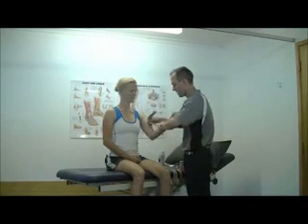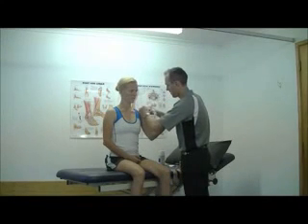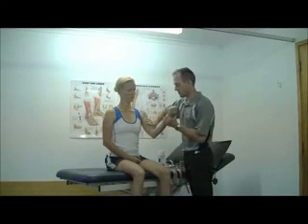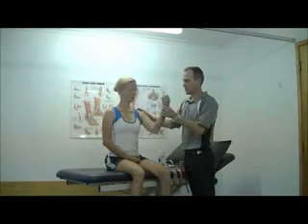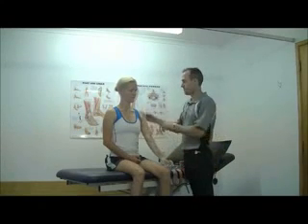So again, in some flexion, we could apply this with a significant degree of stretch. In actual fact, we could continue this right up over the shoulder to assist the scapular repositioning or encourage correct scapular positioning. So now this will allow full extension and then spring back into flexion as well.